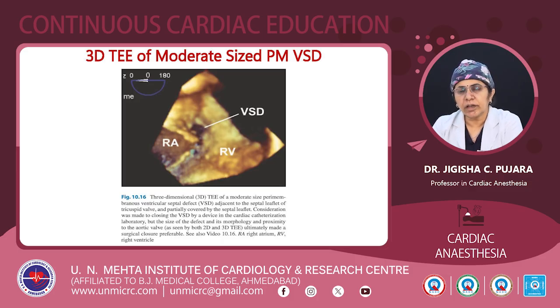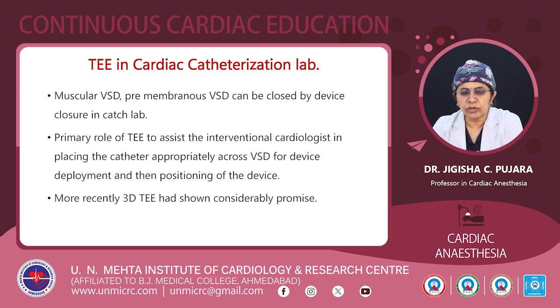and any residual VSD during the surgery can also be well visualized, and the exact location of the VSD with regard to the other structures can also be seen very nicely with 3D. So nowadays 3D is emerging as a very useful tool for VSD closure in congenital heart disease.